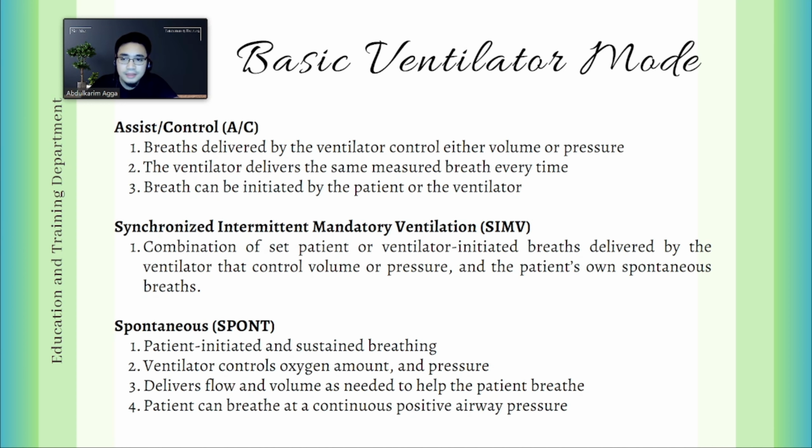The patient and the ventilator will meet halfway, 50-50 of the effort, so that the patient can breathe easily. Comparing this to your AC mode, when you say AC mode, the one in charge is the ventilator in initiating the breathing of the patient, with or without a trigger coming from the patient.